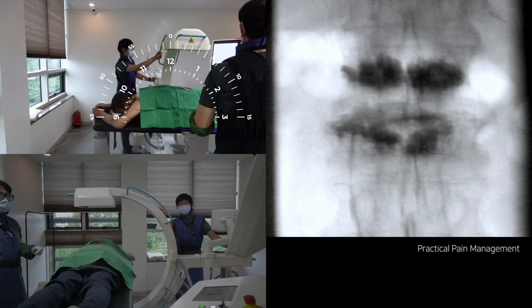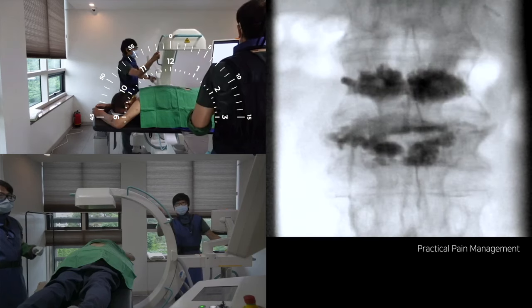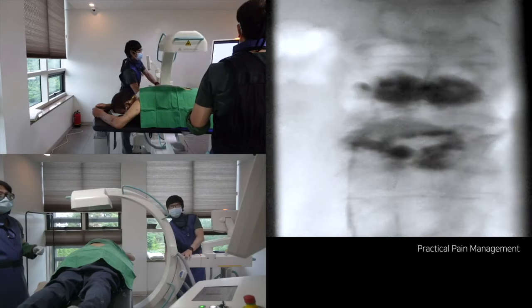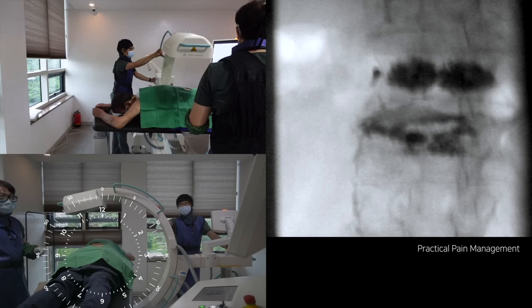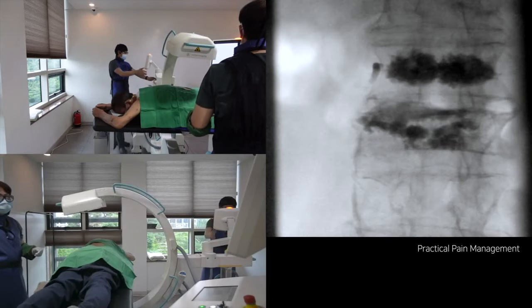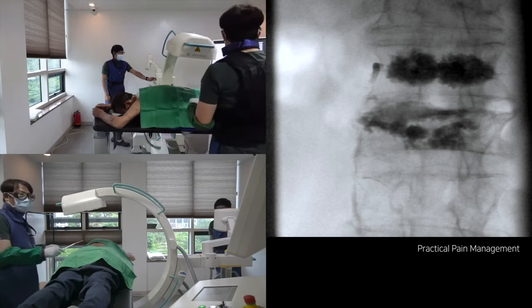The C-arm shows the upper end plate of L3. I will tilt the C-arm caudally to align the L2 inferior end plate — it is about 3 degrees. And then 5 degrees rotate to the left ipsilaterally to select the left L2 nerve root. Usually, I need a mild degree of rotation in the upper lumbar spine.